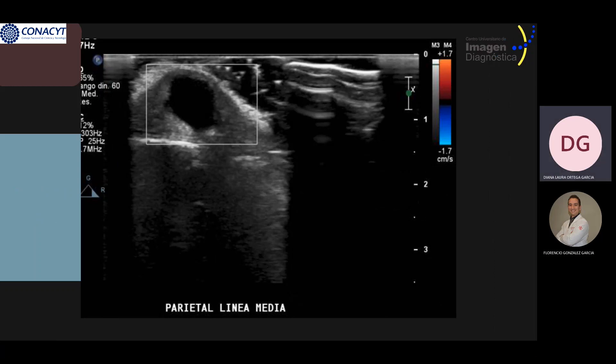The next image corresponds to a color Doppler ultrasound demonstrating the absence of flow pulsation.